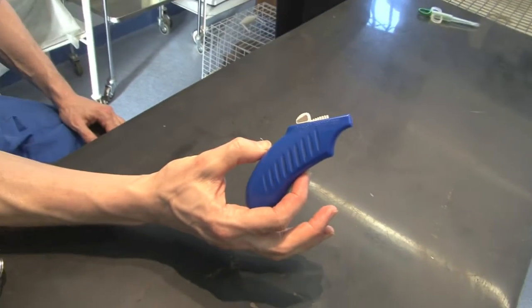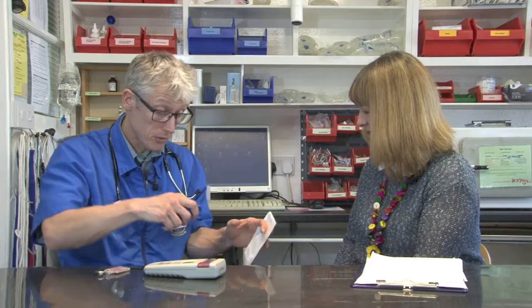So how do you actually fit them? The needle goes into this little gadget here and the chip sits inside. We can show a close-up later. Then, just as we would with any injection, we insert the needle under the cat's skin and press the plunger, and in the chip goes.